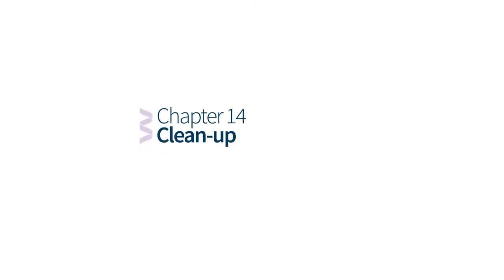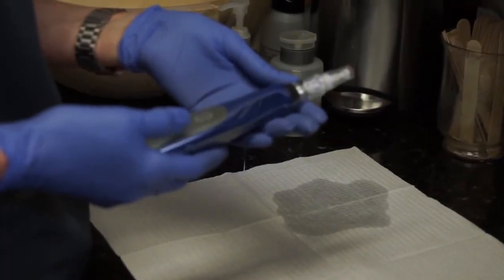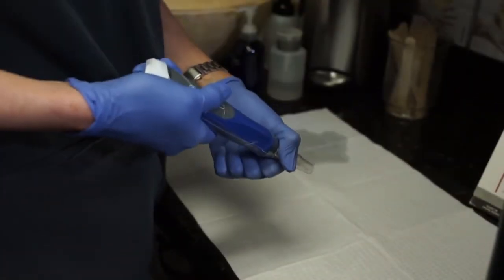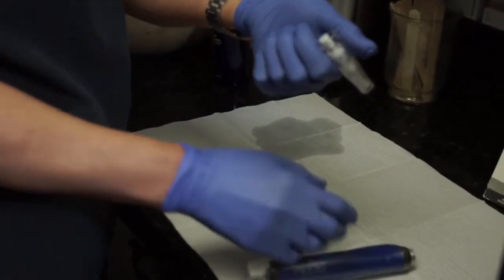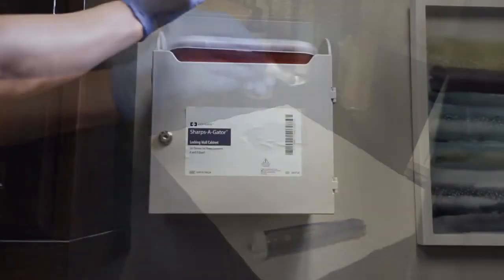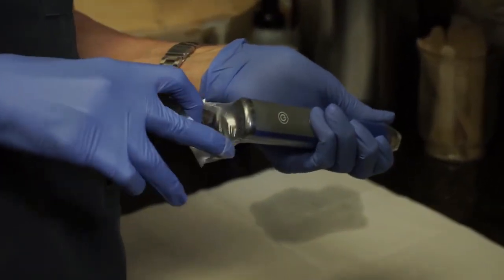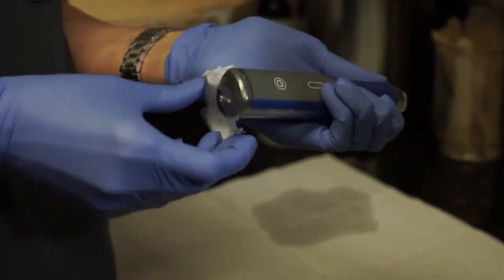Cleanup. To remove the cartridge, hold the SkinPen Precision perpendicular to the floor or with the cartridge attachment tip pointing downwards. Use one hand to remove the cartridge and the other to hold the device. Dispose of the cartridge in a sharps container. Continue to hold the SkinPen Precision device perpendicular to the floor with the cartridge tip pointed downwards, and pull apart the adhesive strip of the biosheath, careful not to touch the device with your gloved hands.